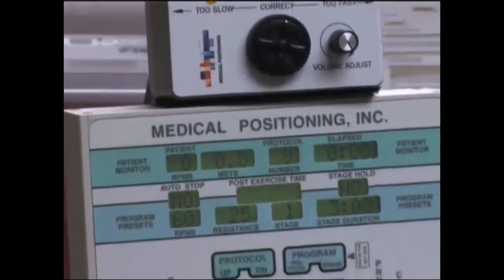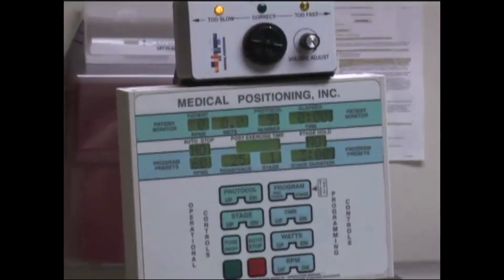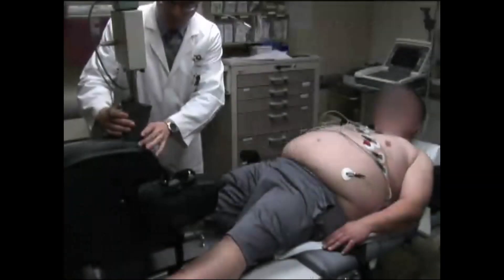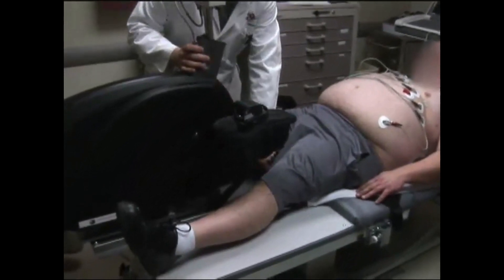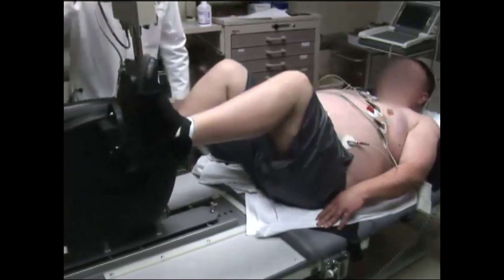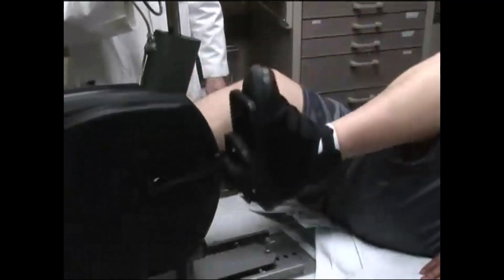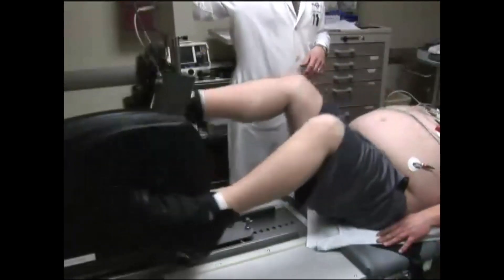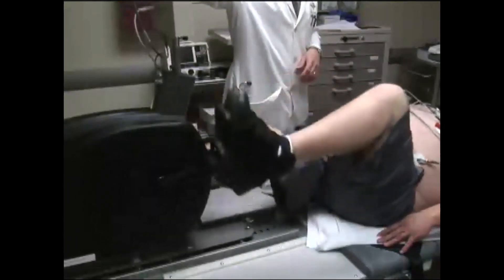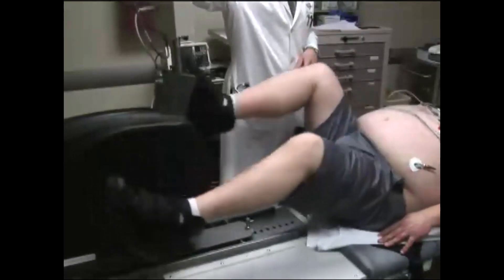The most widely used bicycle stress protocol utilizes fixed pedal speed with increasing resistance in a staged manner every three minutes. The patient is positioned on the stress table and the patient's feet are strapped into the pedals, which are then repositioned to optimize pedaling comfort. During pedal downstroke, the patient's leg should be slightly bent. Explain to the patient the stress testing protocol and how to monitor pedal speed using the metronome function. Allow the patient to pedal without resistance to get comfortable with the bicycle and speed of pedaling.